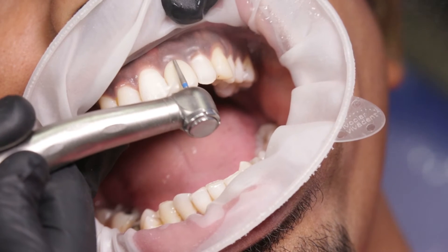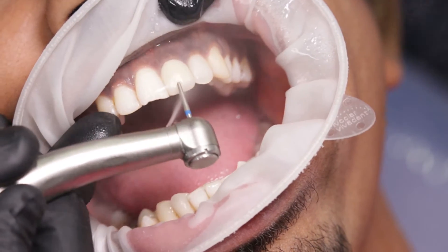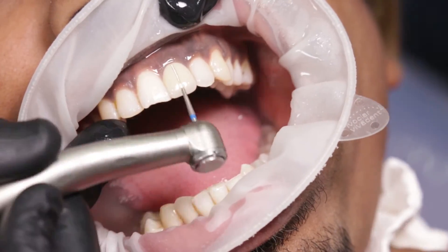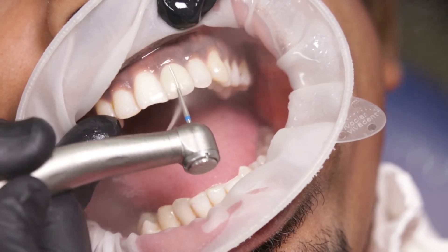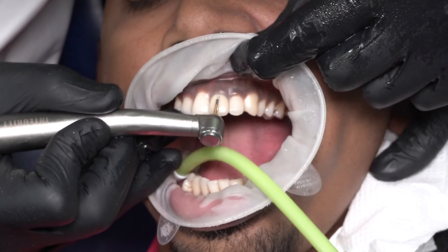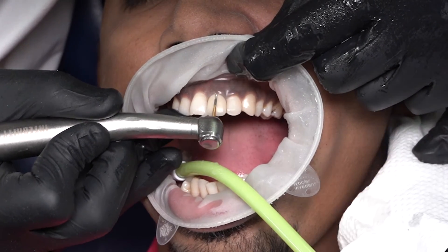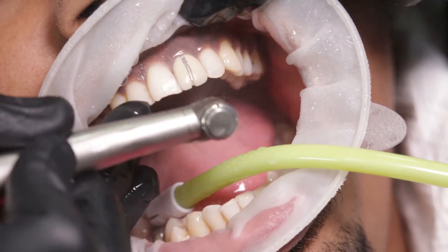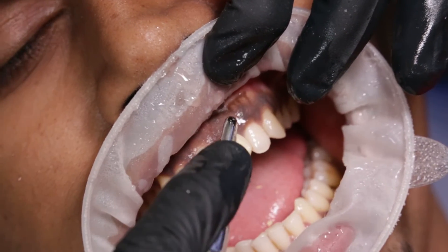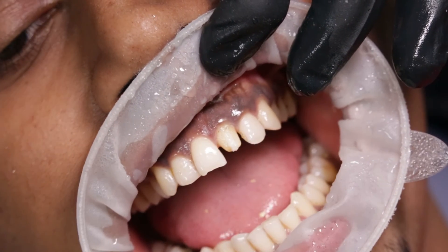My plan is to cut this crown out and since it's a vital tooth I want to be as conservative as possible with the preparation. I am using a diamond bur first to get the porcelain layering out before switching over to the metal-cutting carbide bur to cut the PFM framework and exposing the tooth underneath. Using soft and gentle strokes and letting the carbide do all the work, my goal is to expose the tooth and use the crown remover to pry the crown out. I also have a horizontal cut to weaken the cement bond further, and you can see how easily the crown comes out with the Christensen's crown remover without any trauma or discomfort to the patient.